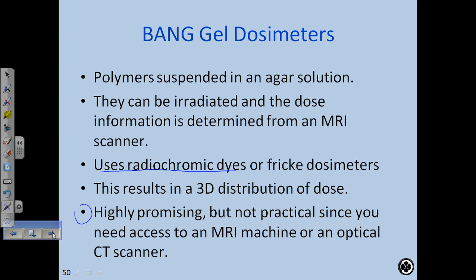You can put it through a CT scanner and scan it, do a treatment plan on it, a 3-dimensional stereotactic treatment plan, and then you can irradiate this phantom like you would a patient, put it in an MRI, and now you're comparing the 3D treatment plan to the 3D MRI image. So you get tons of information if you can compare it.